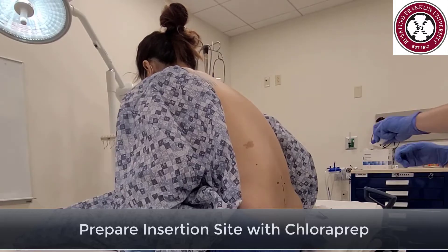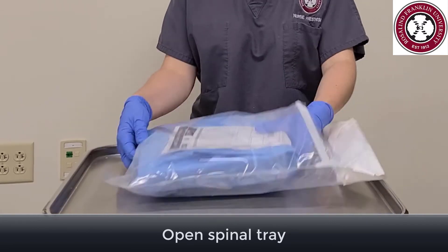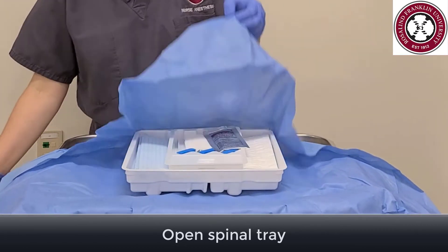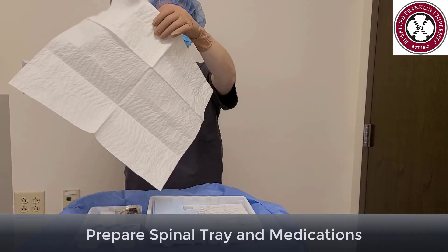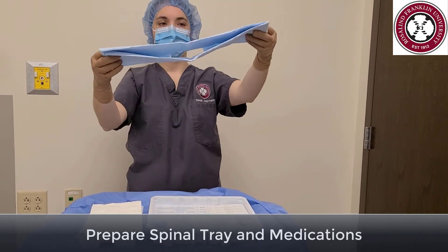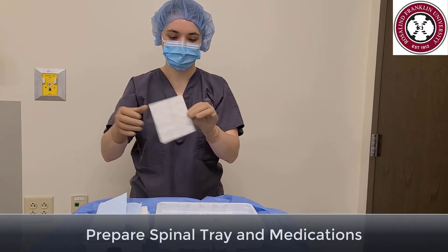After performing a timeout and washing your hands, clean the patient's back with chloroprep. Warn the patient that it will be cold and start at the insertion site going in concentric circles. It is important for the chloroprep to dry for at least three minutes to prevent neurotoxicity. While it is drying, prepare the spinal tray. The spinal tray can be opened with clean gloves, making sure not to contaminate any sterile areas. After donning sterile gloves, prepare your spinal tray and medications. Because we used chloroprep, the betadine is not needed. In the kit is a sterile barrier to place behind the patient on the bed, a fenestrated drape with an adhesive strip to secure to the patient's back, and pre-made and blank labels for labeling syringes.